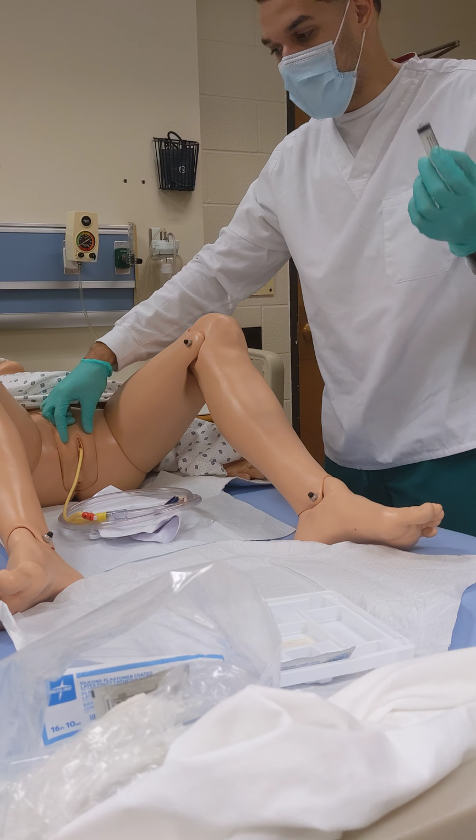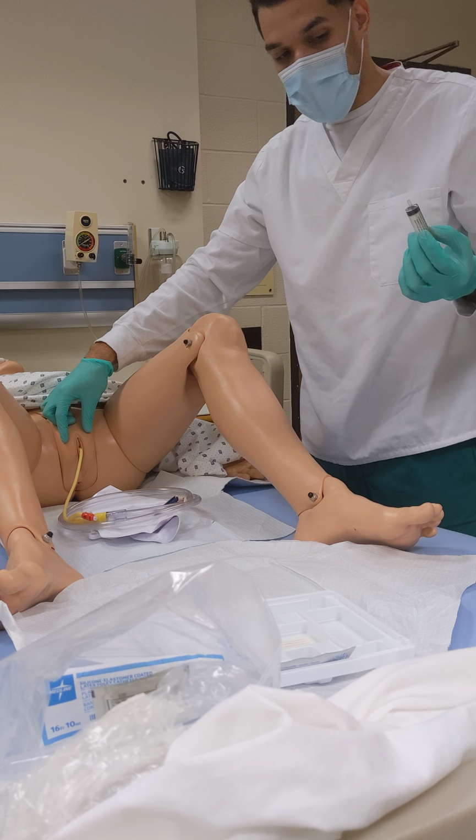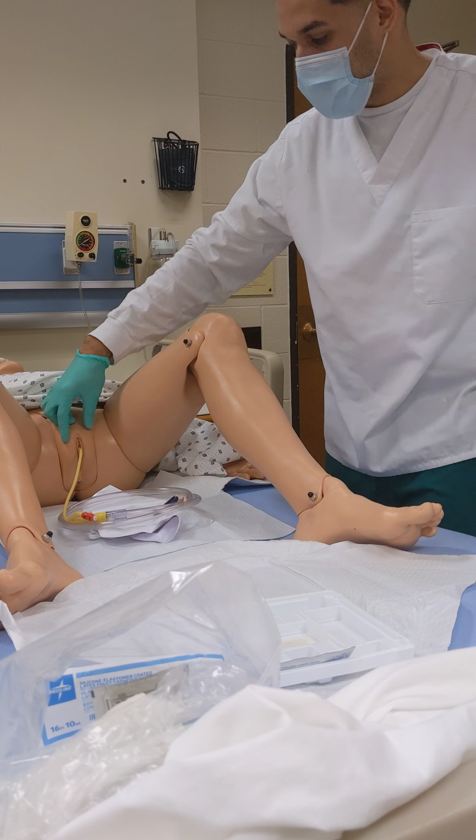Now this doesn't go into a regular garbage, this goes into a sharps container for safety purposes, but for right now we'll say this is the sharps container.